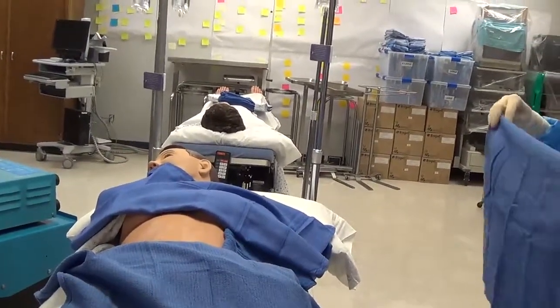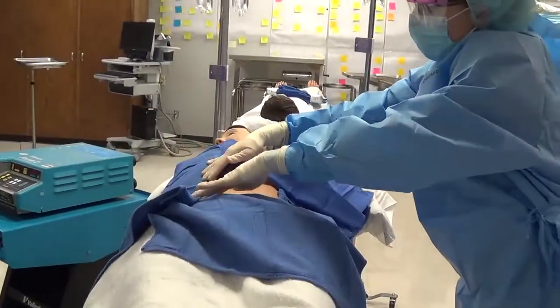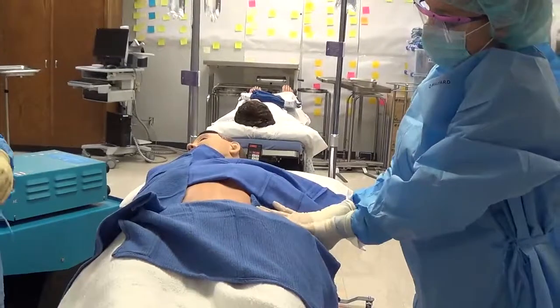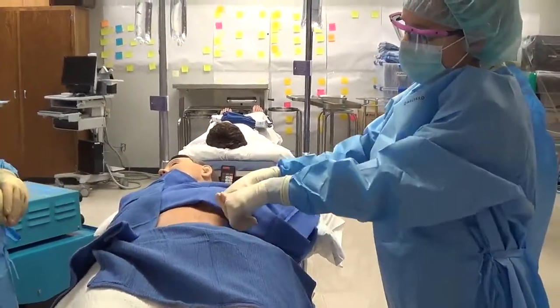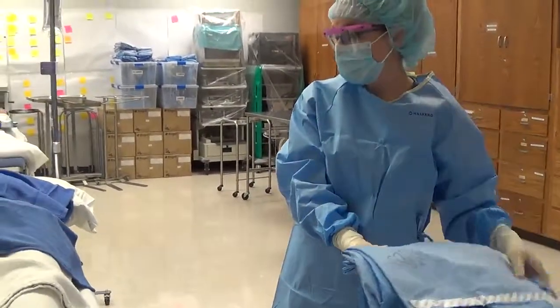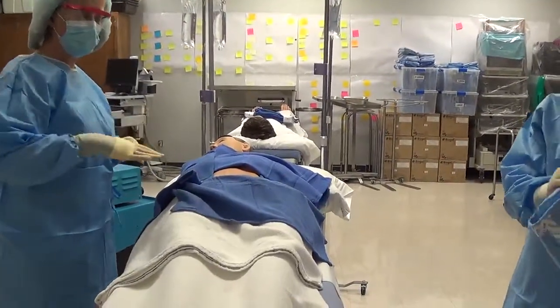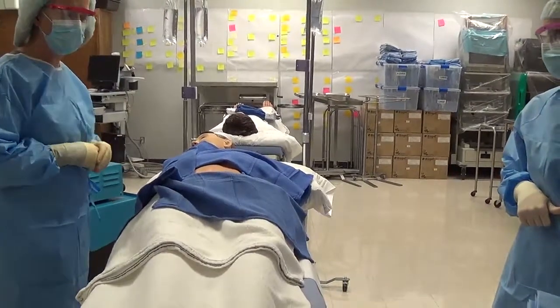The final towel has the cuff towards you — this one you have to be really careful about the front of your gown. Reach across and place that over there. If you need to back them up, grab right around the incision site and never stick your fingers underneath, because we never place our hands somewhere we can't see them. Resist the urge — I know you want to reach over and straighten it, but you can't without risking contamination.